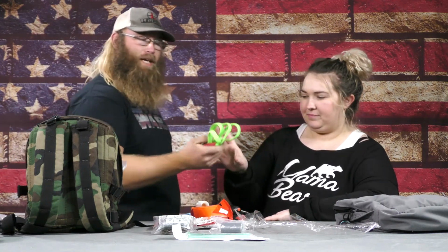Now with these ones, I'm going to say too, look away as you do it, because sometimes you get it super tight and it gets deep in there. If you're staring at it, I had it happen before: someone pops out, punched me in the face, and my lens fell out. Just look away. That's all you've got to do.